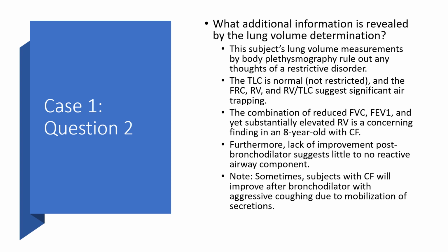Furthermore, lack of improvement post-bronchodilator suggests little to no response to bronchodilators. Again, that doesn't mean they shouldn't be given, but the benefit is going to be less than what we'd see, for instance, in the next case we're going to look at. Note sometimes that subjects with CF will improve after bronchodilator, but that's also coupled with aggressive coughing due to mobilization of secretions. So it's not bronchodilation, it's that we've been able to mobilize secretions, and that's really aided some of these patients post-treatment.